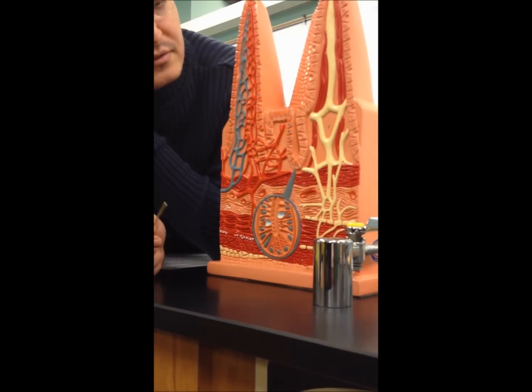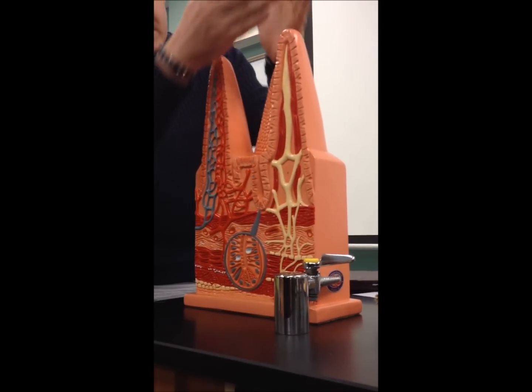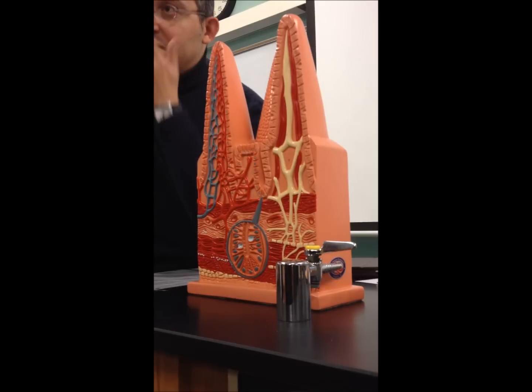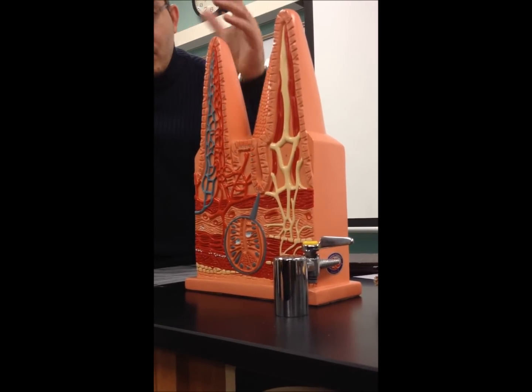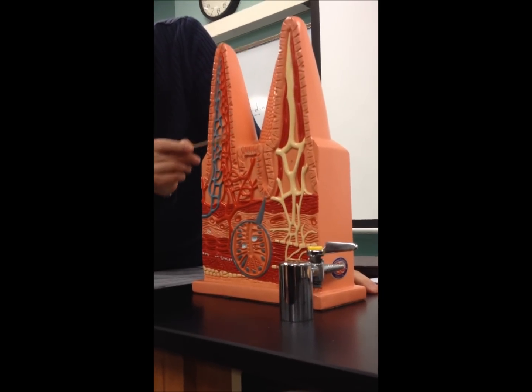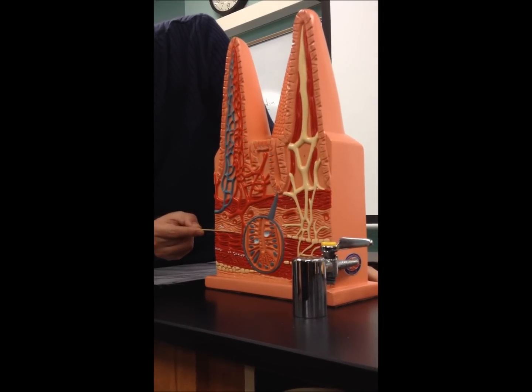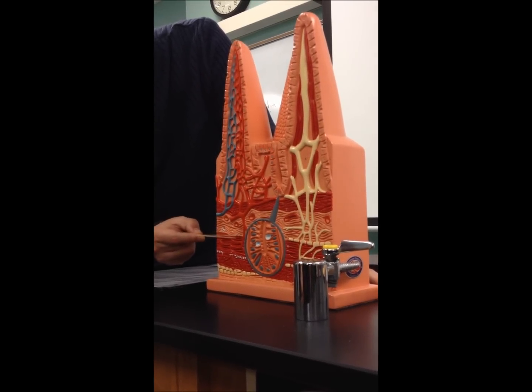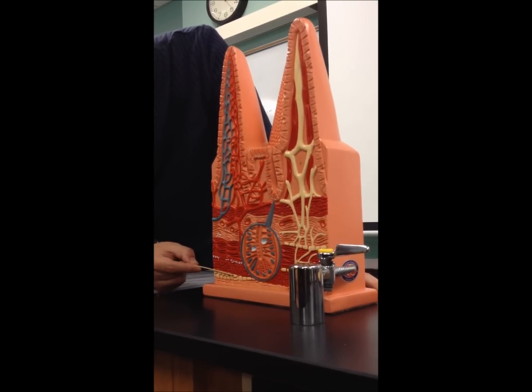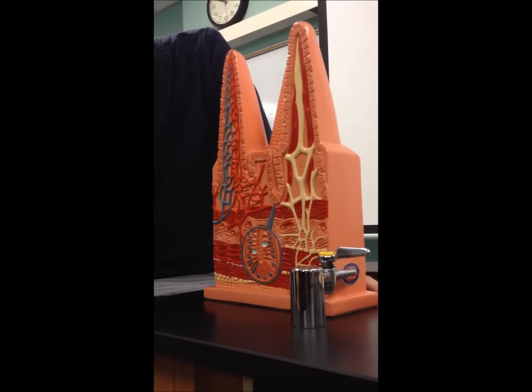Again, all this shows the layers forming the wall of the small intestine. Four layers. From here all the way down to here, mucosa. From here to here, submucosa. From here to here, muscularis externa. Then after the muscularis externa, serosa. Okay, so let's understand the mucosa first.